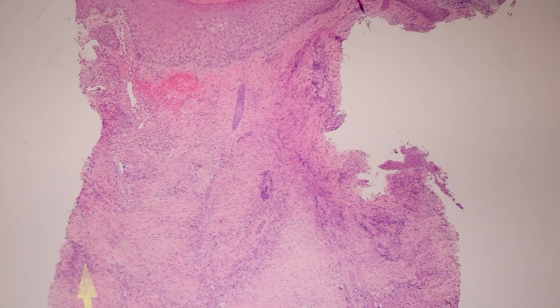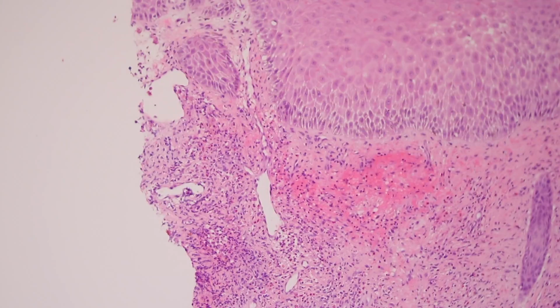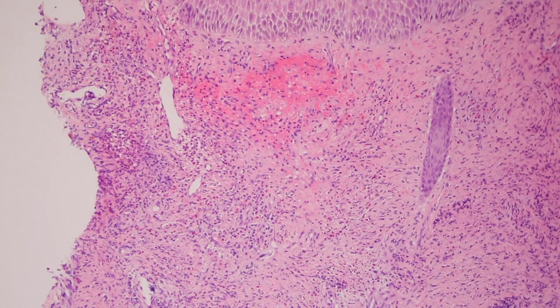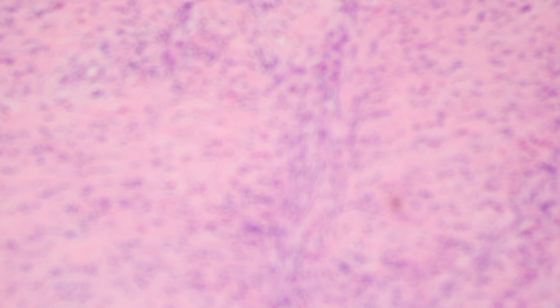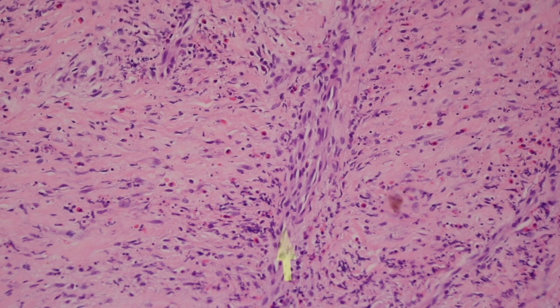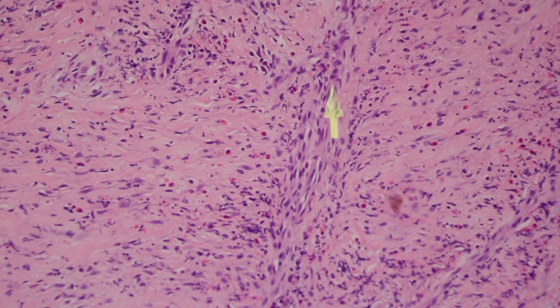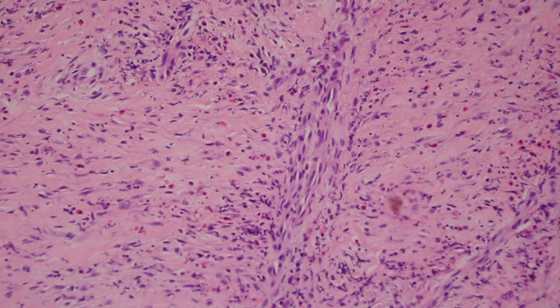This is really rare, at least in my experience. I've only seen a couple cases of EED. It's a very uncommon thing. Granuloma faciale is relatively more common from what I've seen. So again, here's a vessel that's kind of left over in here. A couple vessels, actually. You've got two little lumens together, and some neutrophils and debris around it, eosinophils, and then tons of background sclerosis.